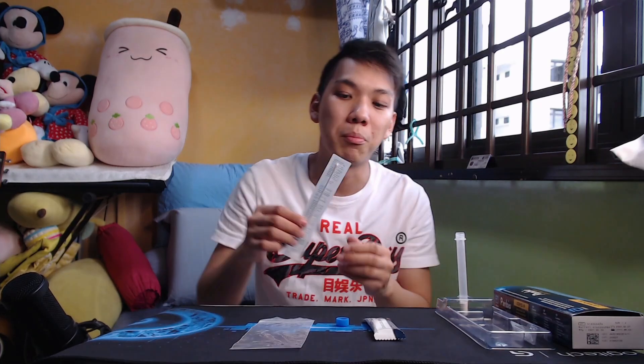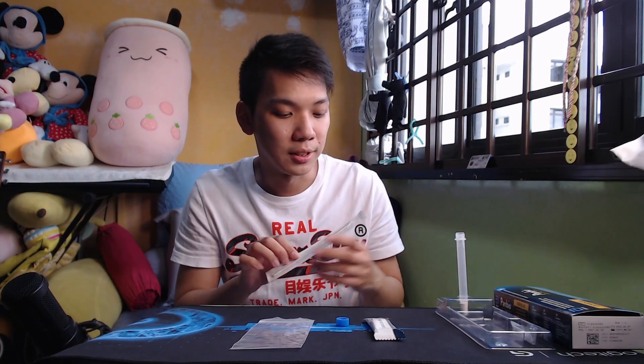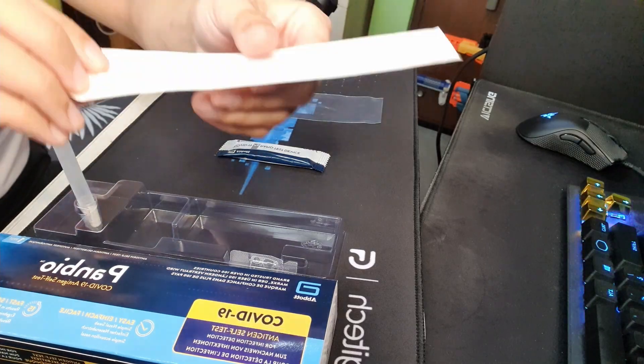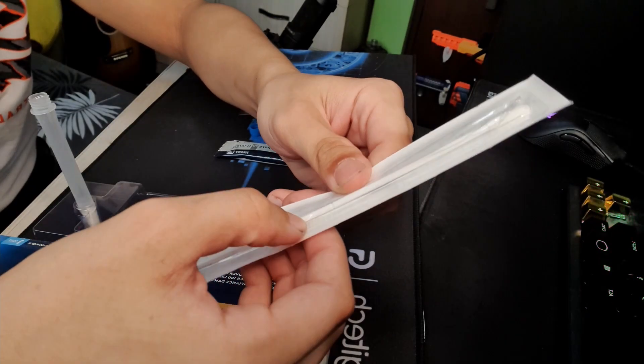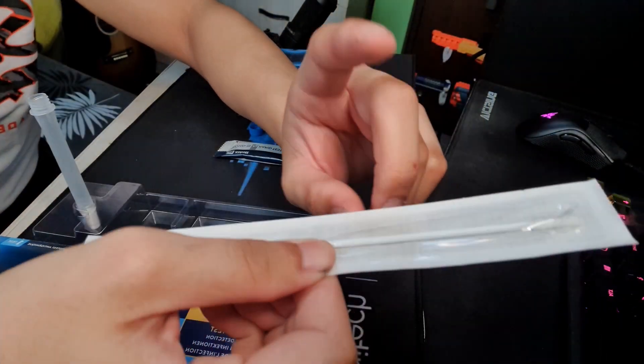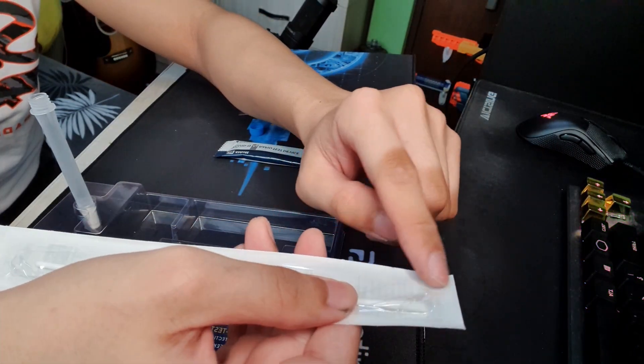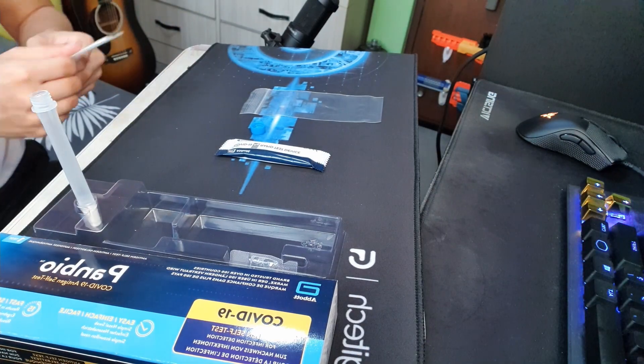Step three: prepare the swab — I like to call it the stick. You should notice there is a marker on it — this is where you break the swab later. More importantly, this is the tip of the swab that will be going up your nose. When you open it, make sure you don't open the tip side, because this needs to be clean — free from hands and whatever — so that the results can be as accurate as possible. Open the other side.